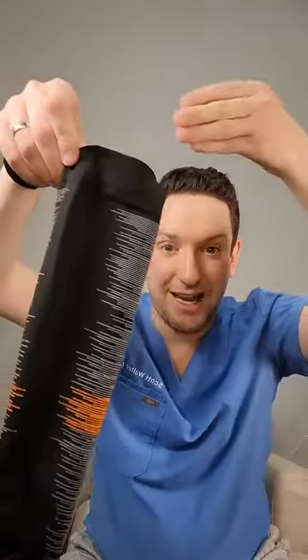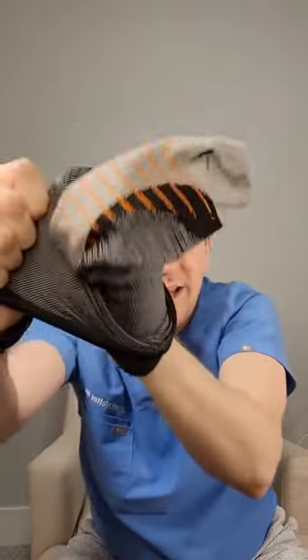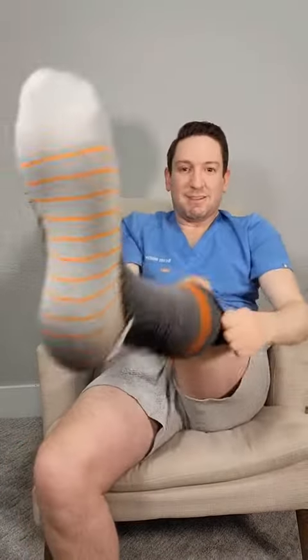Step 1, you're gonna put your hand into the sock and grab the heel, like you're making a puppet. You're making a frog here. All right, so here we go. And pinch at the heel, and then invert the top of the sock, pulling that out, and now you have an opening. All right? Now, take that opening and just put it on your feet. So fast.